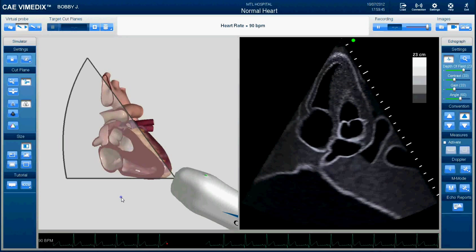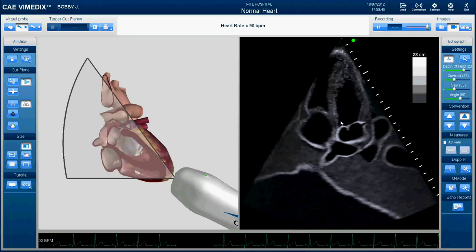This is a specific type of apical long axis view called the apical five chamber view. You can see four chambers of the heart corresponding to the right atrium, right ventricle, left atrium, and left ventricle. The fifth chamber is actually not a proper chamber — it's the aorta. So this is the aortic valve, one of the semilunar valves. You can see the mitral valve is open and the left ventricle is starting to expand in volume. This is a fairly decent shot of the apical five chamber view, which is one of the many views you'll learn about as you progress through your time in the clinic.